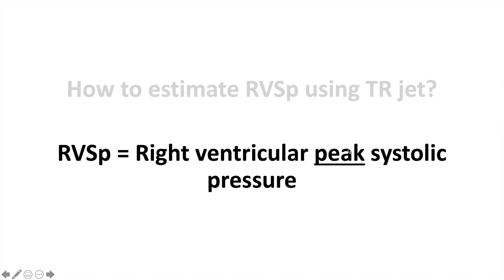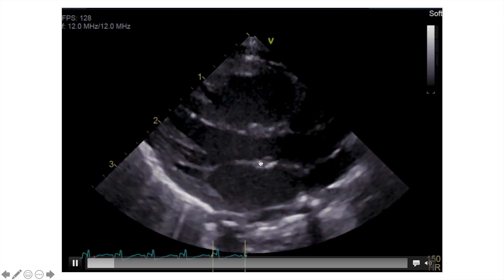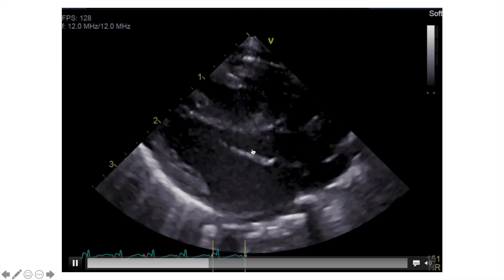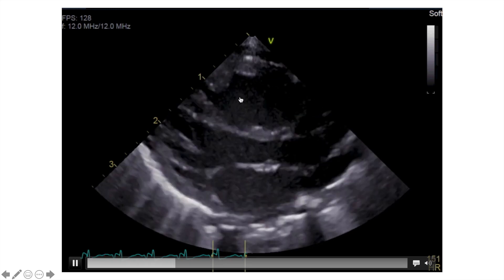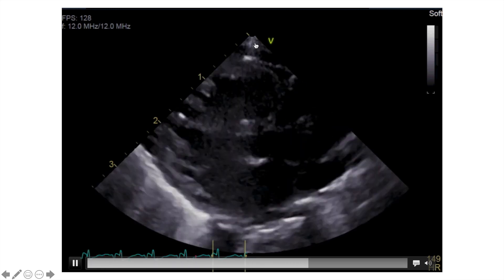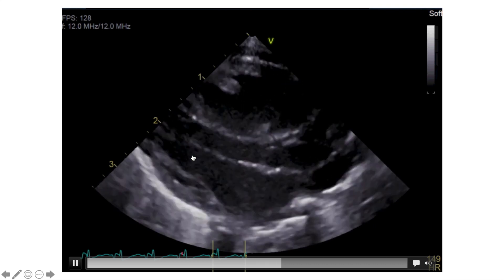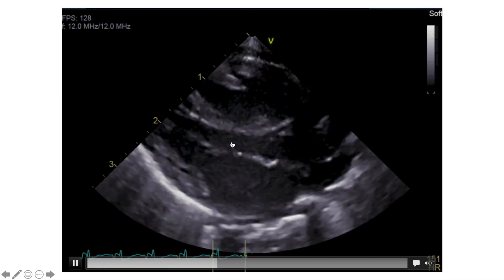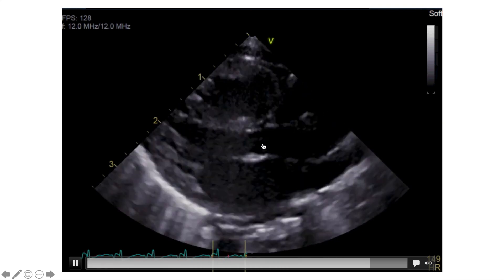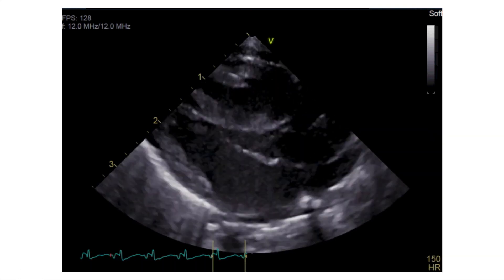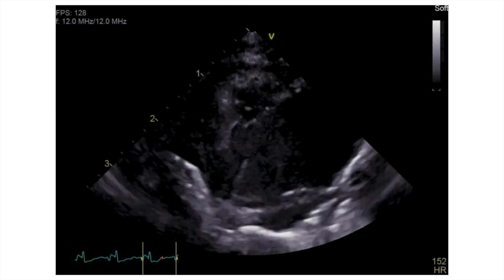This is the parasternal long axis view, just to help you with the anatomy. The right ventricle is here on the top, very close to the probe. Then this is the left ventricle, the left atrium, and the LVOT with the aortic valve. From that view, with a little bit of tilting and rotation, we go to the next view.